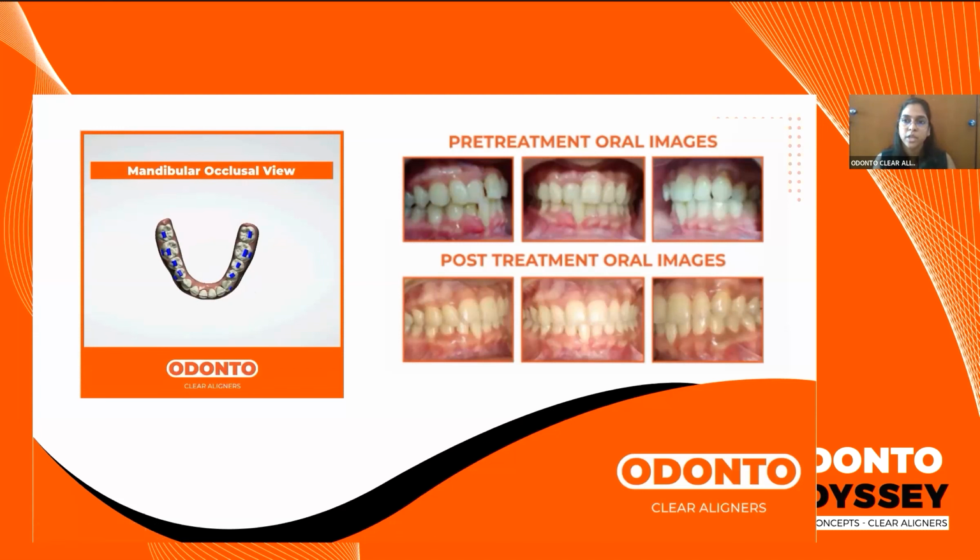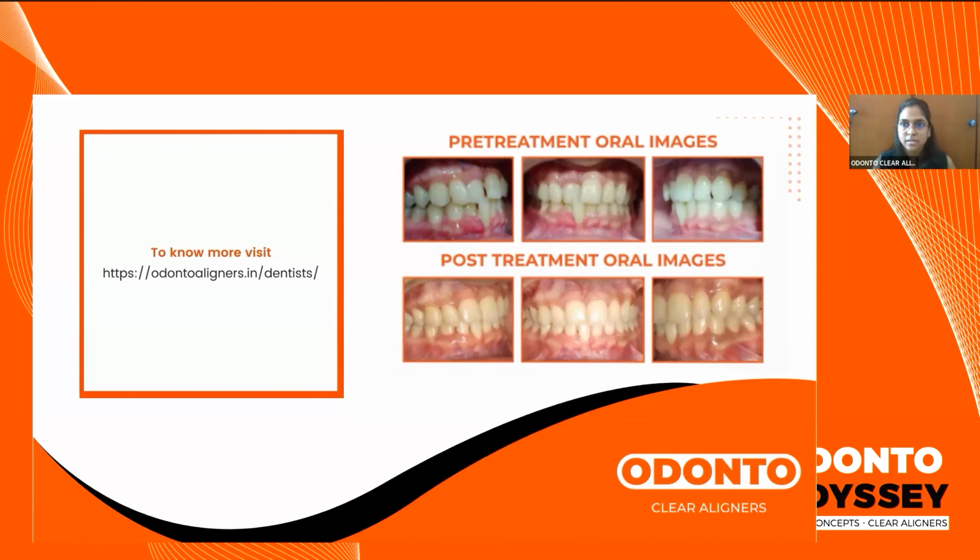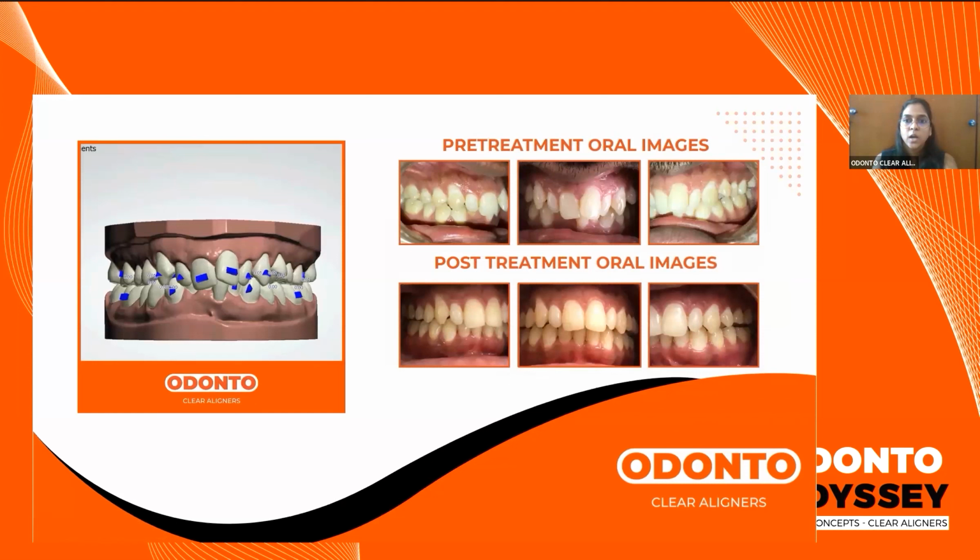They come programmed into the aligner, and that helps to open up the bite and allow for your bite to jump. So such cases also can be done very easily with your aligners, and you receive a good occlusion provided the patient wears it, because patient compliance is one of the keys to achieving a good result when it comes to aligner treatment.